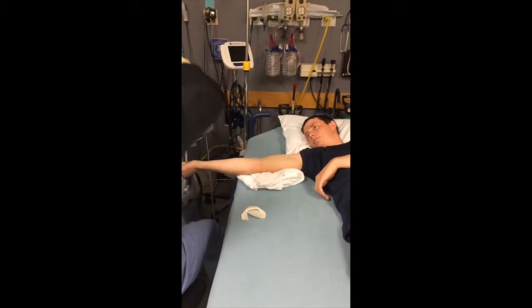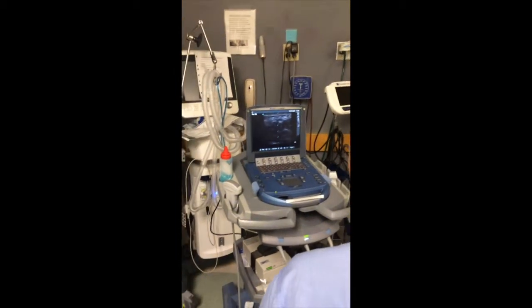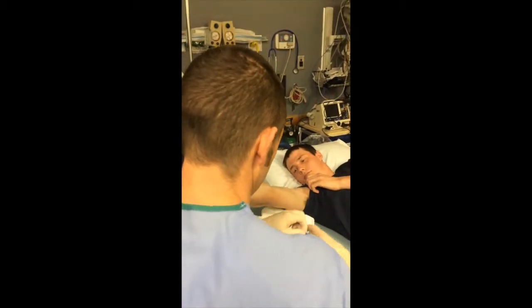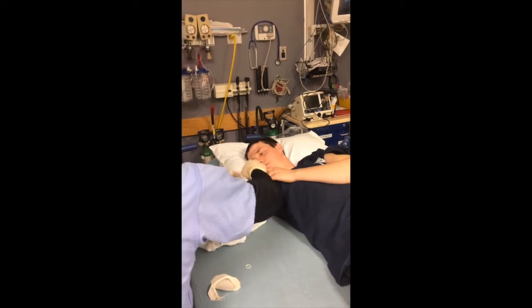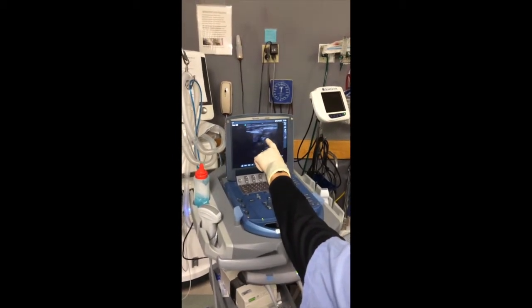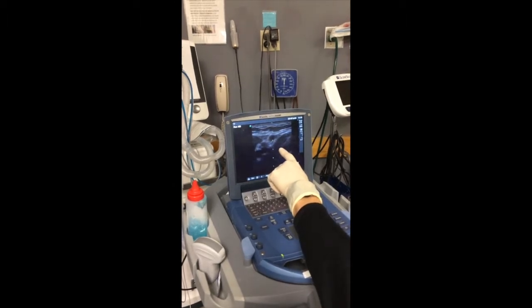All right. So again, just as before, you want to have a nice C-grip on the probe, pinky finger just to base it. Again, you want to find your target vein. And there it is. I'm going to quickly put on a tourniquet. You don't always have to have a tourniquet, but once you start to insert, if you don't have a tourniquet on, sometimes the vein will continually tent and it's tough to pierce through the actual side of the vein. And of course, it makes the vein pop out a little more. So there on our screen again, I've got the target vein compressing nicely. I'm just going to run it down — again, you kind of want to be in the middle third of the arm.